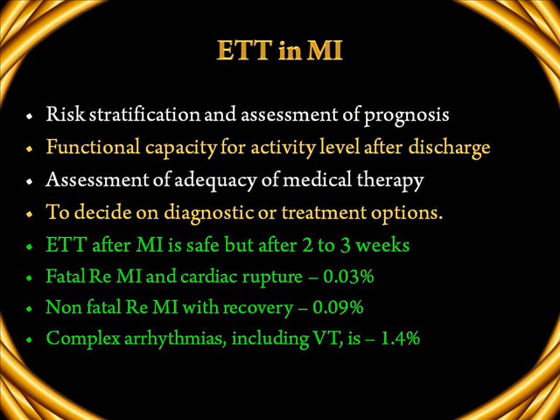Sometimes we need to use ETT in patients who suffered myocardial infarction. Risk stratification and assessment of prognosis are based on the ETT results. Functional capacity for activity level after discharge and for prescribing the amount of activity the patient has to undertake, either at home or at work, is dependent upon the results of the exercise testing. Assessment of the adequacy of medical treatment is also sometimes done using exercise testing.